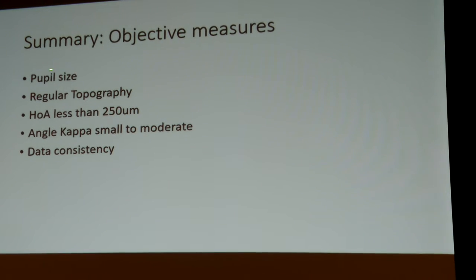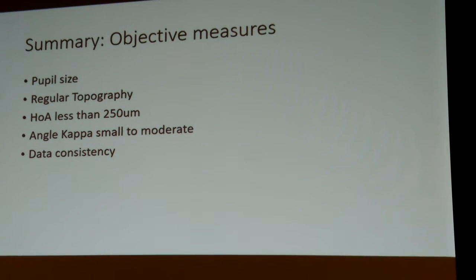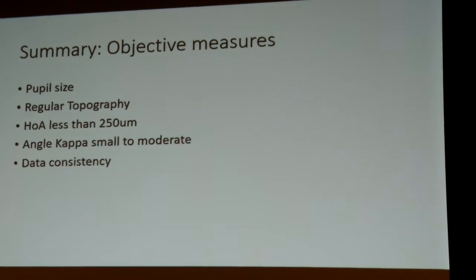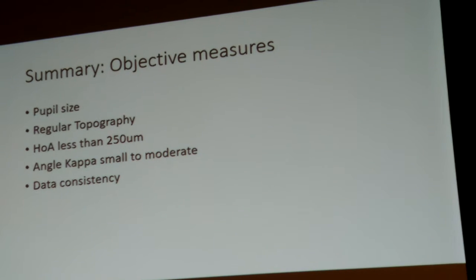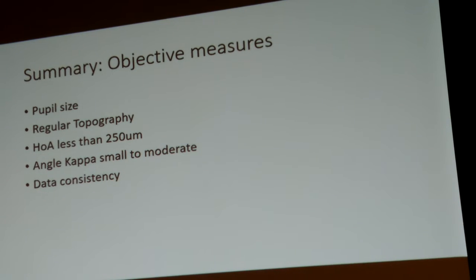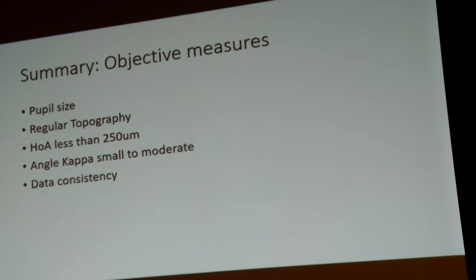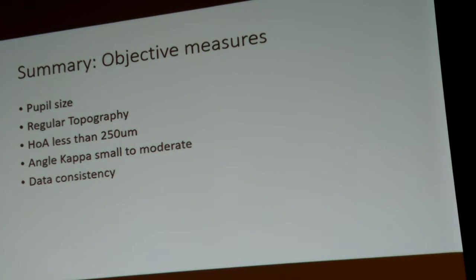So for the objective measurements, pupil size as well, there's a little summary. In our opinion, pupil size should be a minimum of 2.7, 2.8 millimeters under photopic conditions. If it gets smaller with the refractive lenses, then probably you can't have the full benefit of those lenses, because the pupil area is too small for the light to go through the near and through the distant segment. And then in combination with a large angle kappa, either of the segments is even smaller. And the pupil shouldn't be bigger than 6 millimeters, obviously, because the optic zone of most lenses is 6 millimeters.